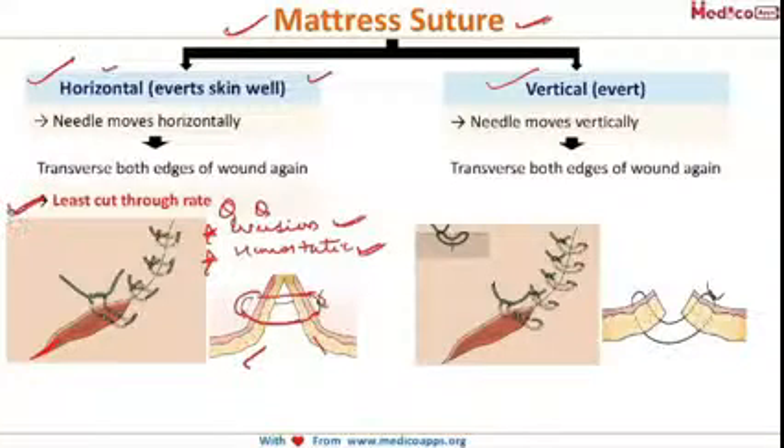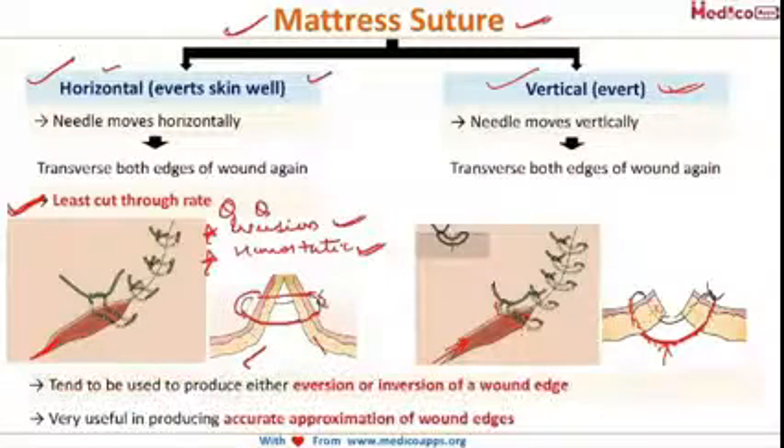Moving to the vertical mattress suture — the needle moves vertically to the other side going deeply, then comes out superficially. So we go through deeply and come back superficially in the same line. This vertical suture also helps in the eversion of the skin, and this mattress suture is also helpful in producing accurate approximation of the wound edges.